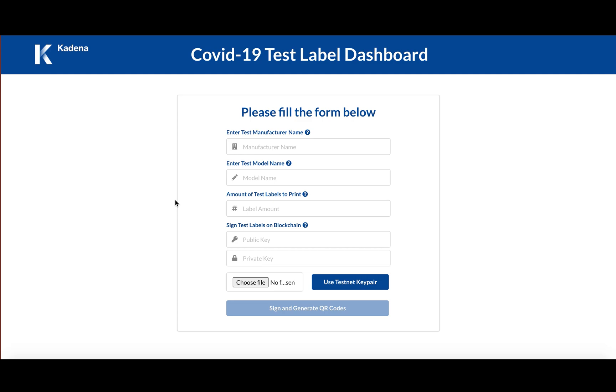And these QR codes have a reason to exist, which is what I mentioned above, which ensures that these tests can only be used once and are traceable back to their original manufacturers or printers of the QR codes.